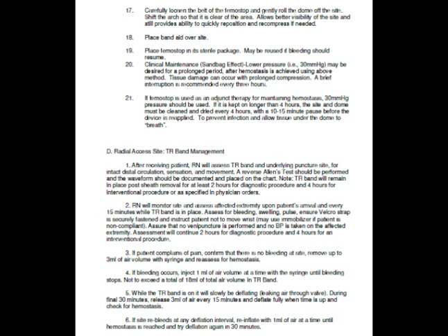If you haven't seen a TR band and you would like to, please just schedule some time with me and I'll let you play with the TR band. But basically it's a bracelet that has a little pillow that you fill up with air and it holds pressure on the site.